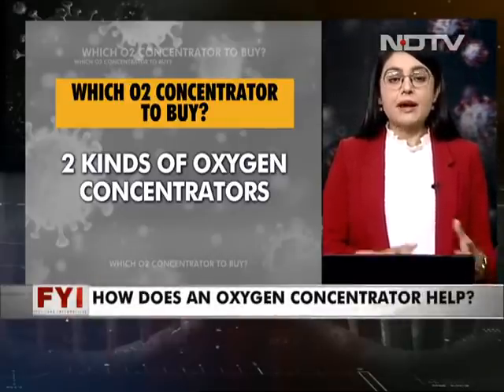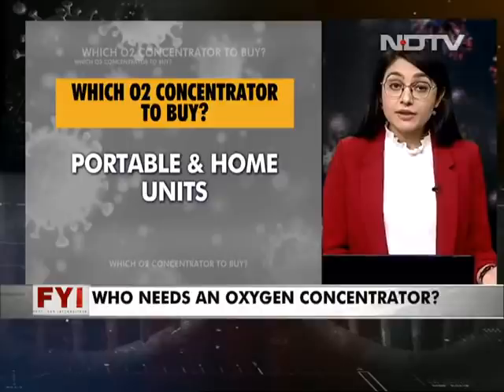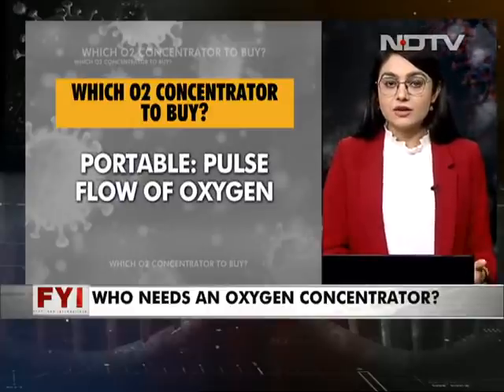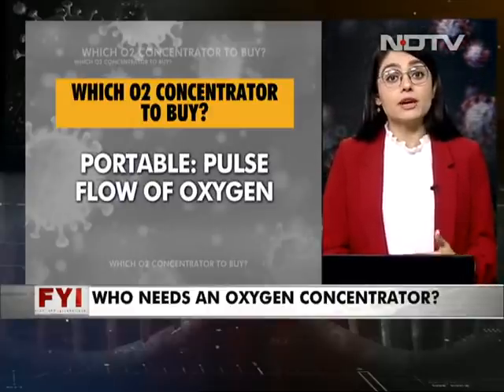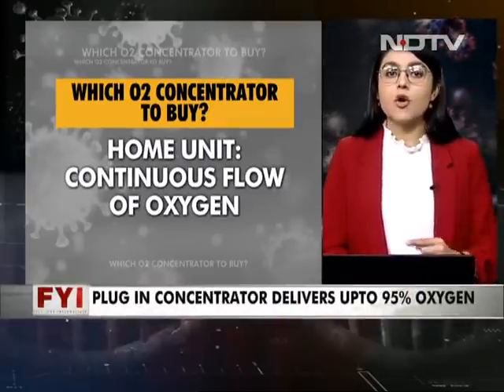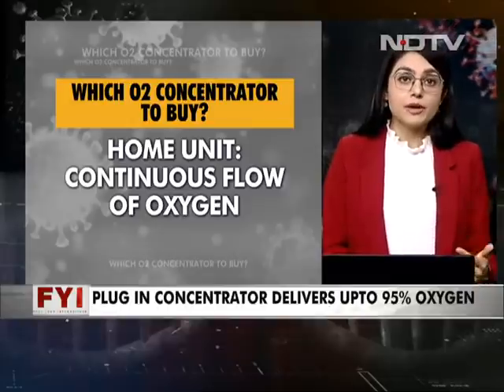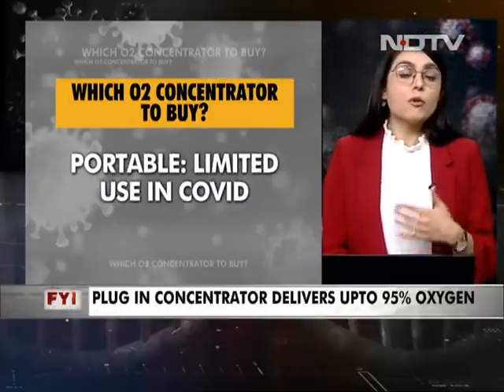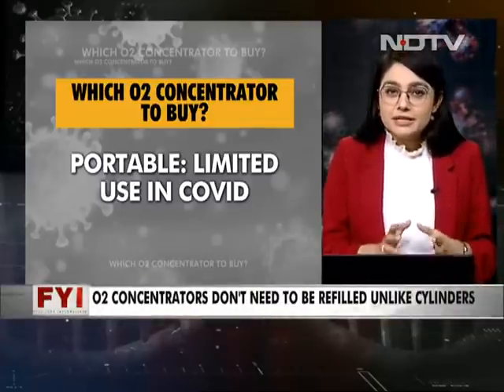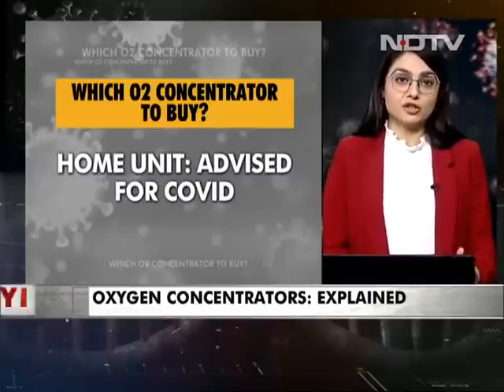Now, once we have established that, let's look at which one you should really buy and how many of them are in the market. Broadly speaking, there are two kinds of oxygen concentrators in the market. There is a portable unit and there is a home unit. A portable unit, as the name suggests, does not need an electricity source, thus it can be carried around anywhere. A home unit needs a plug point like the one I just used. But importantly, home units give continuous oxygen flow, which is absolutely essential for COVID cases, while a portable machine has pulse flow, which is mostly used for chronic but stable lung diseases, meaning a portable concentrator has a very limited role to play when it comes to COVID.